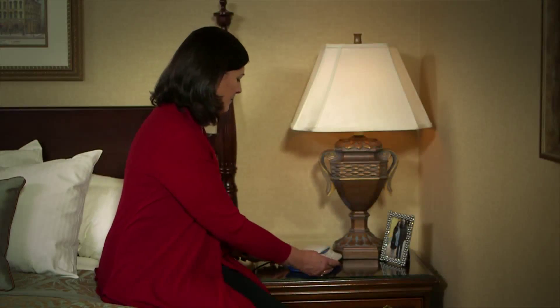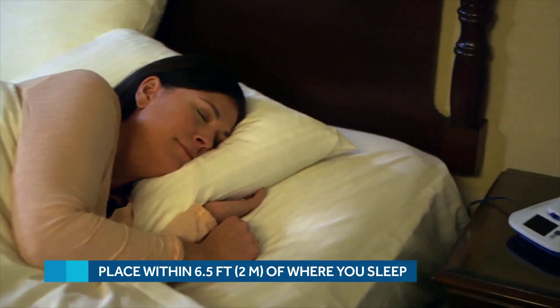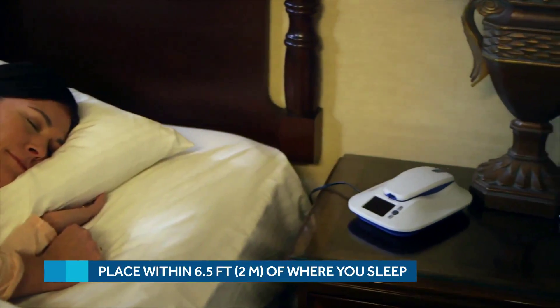Let's walk through the setup together. First, find a good place to keep the MyCareLink monitor. It should be placed within six and a half feet or two meters of your bed. This is because your doctor will program your RevealLink device to send information to the MyCareLink monitor at a time you're usually sleeping.